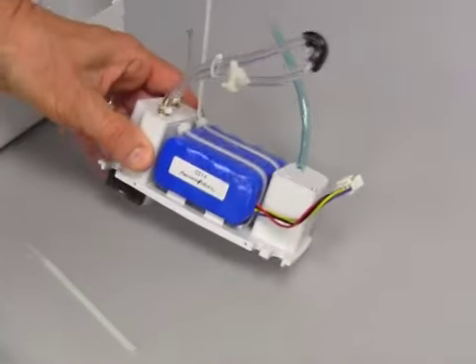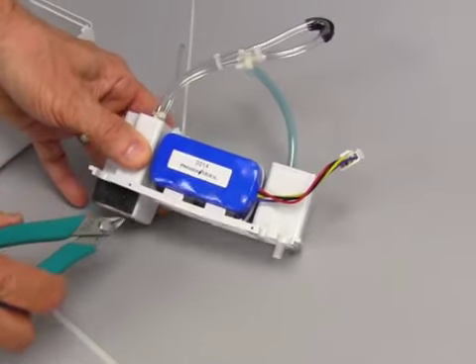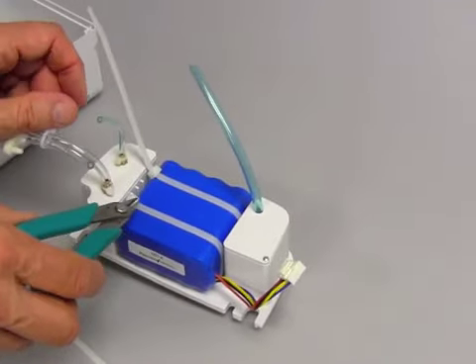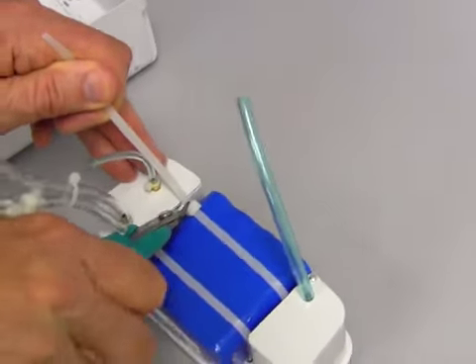This shows the battery reinstalled into the reservoir. You can see from the label, the label is the date that the battery was installed, and also you can see that the wire ties are in place now. I've trimmed one and I'm going to trim the second so that the ends are not in the way.